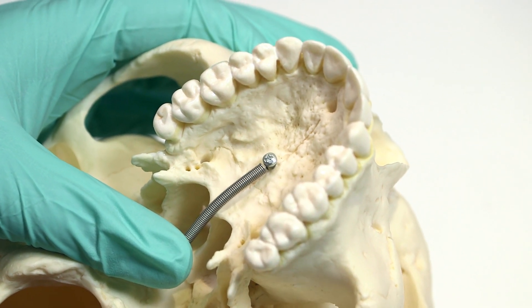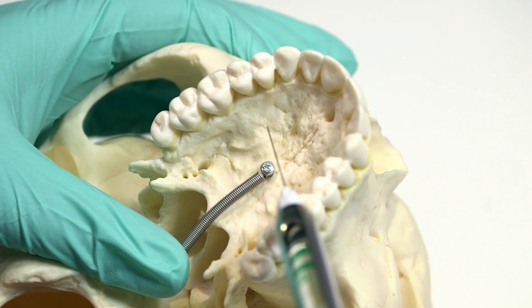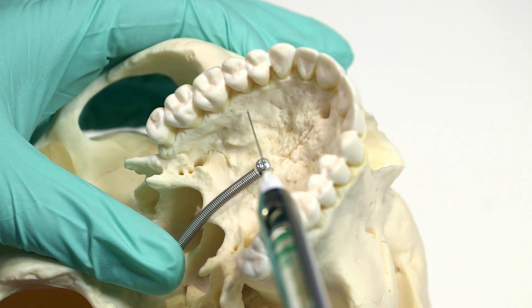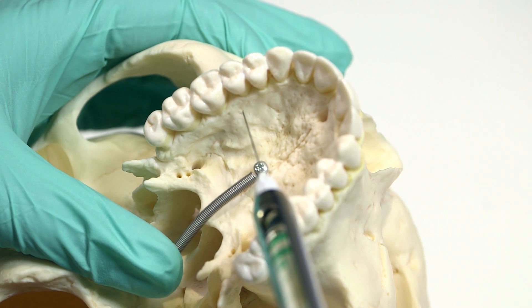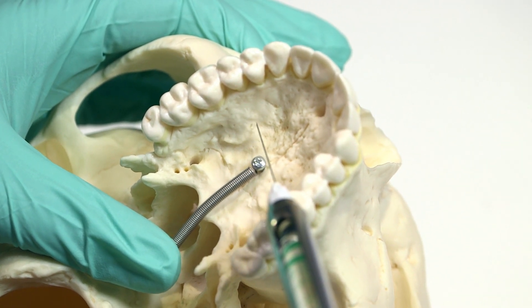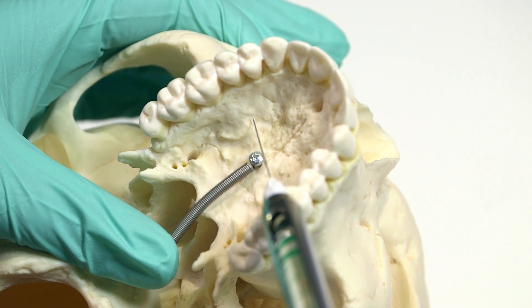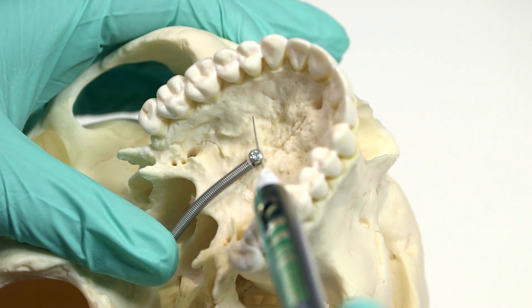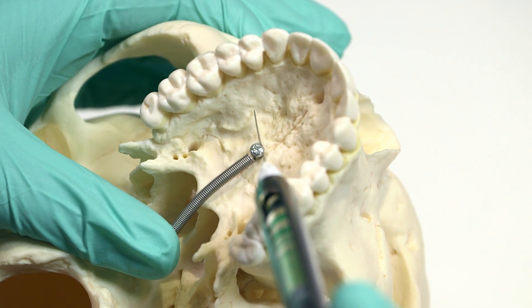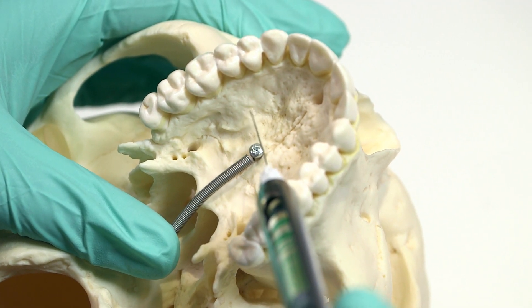The syringe should be oriented so that the needle is inserted at a 45 degree angle to the palate at the junction. The needle should be inserted approximately 1-2mm, then slowly deposit 0.1-0.3mL of solution. Deposit very slowly and you'll see blanching of the tissues.